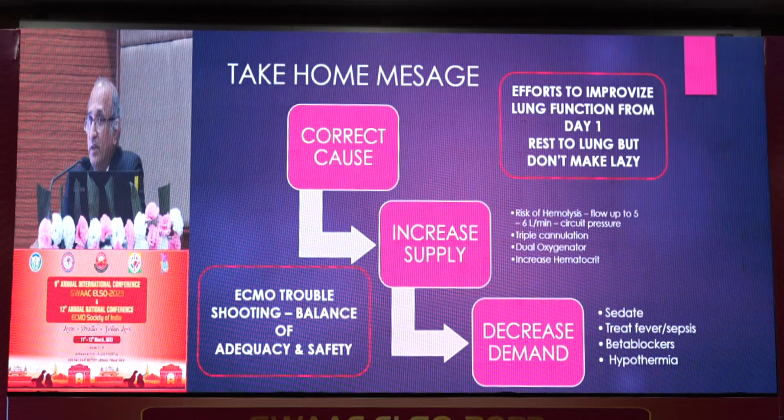The most important thing beyond that is you have to start making an effort from day one for the lung function to improve, because that is what we usually neglect. We always keep on talking about give rest to the lungs, give rest to the lungs. Yes, it is important to give rest to the lungs, but don't make it lazy, because then it will take more time to get up. And the more time they spend on ECMO, the more the risk. Okay. Thank you.